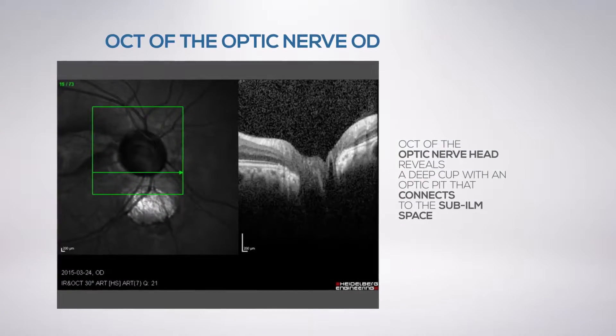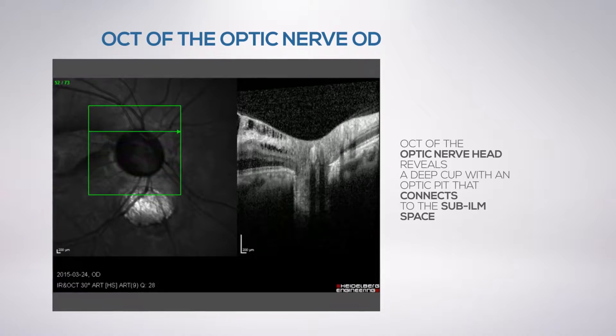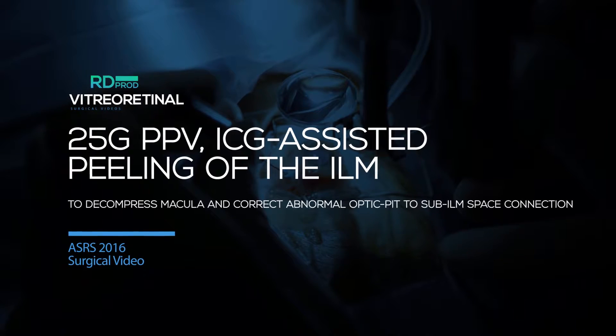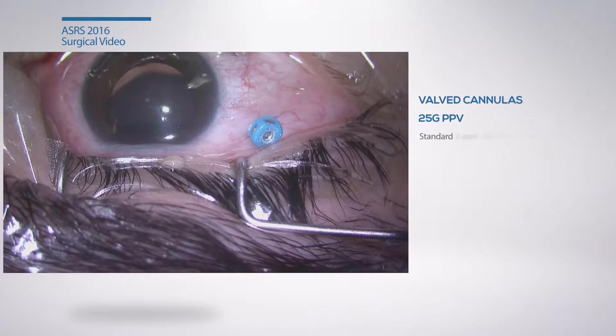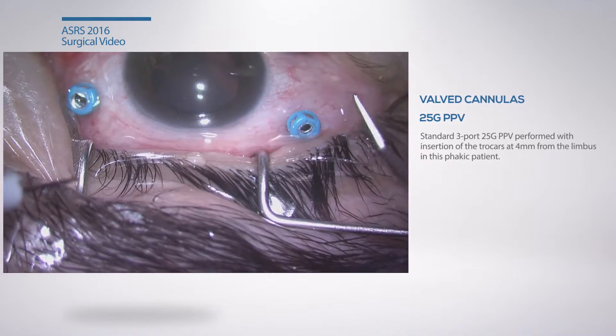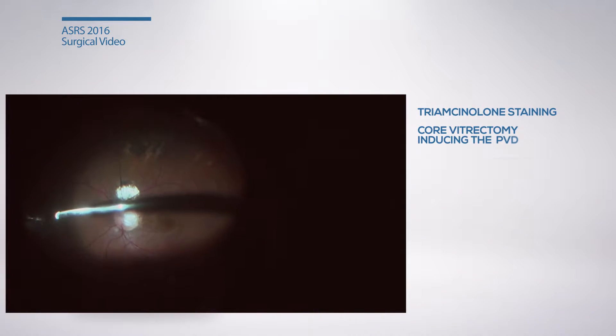The sub-ILM fluid was compressing the underlying retina to a thickness of 184 microns. OCT of the optic nerve confirmed the connection between the optic pit and the sub-ILM space. We elected to perform 25-gauge pars plana vitrectomy with ILM peeling in order to decompress the macula.